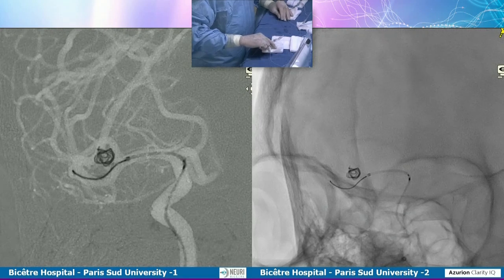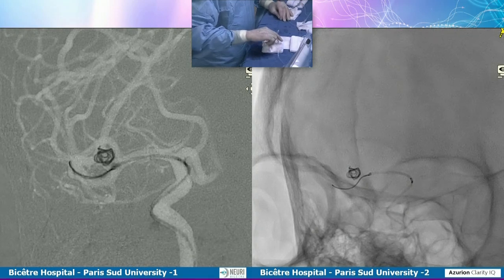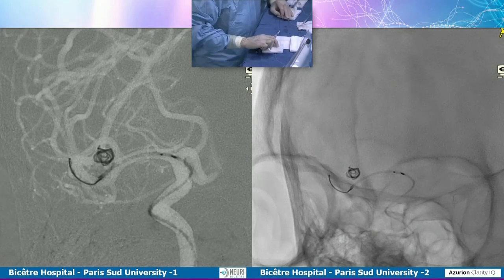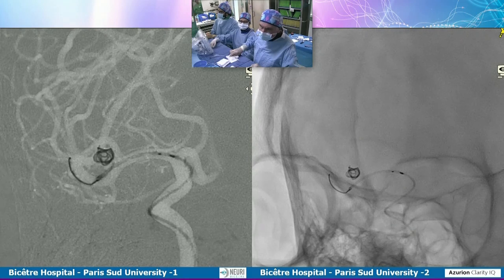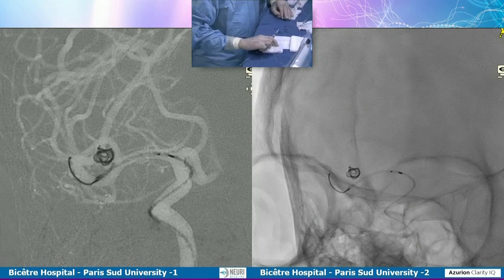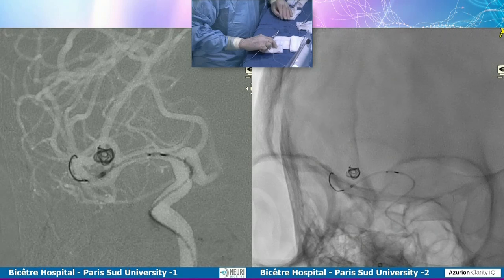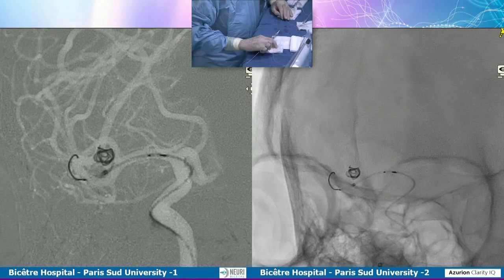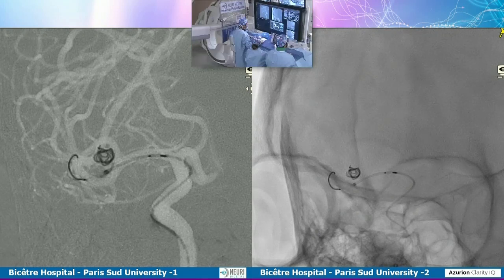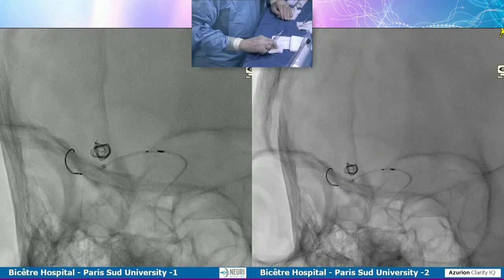Laurent, the simulation that you have would have been a good one to see which of the 2 branches to choose, to see what the flow diverter does. So the simulation provides you 2 pieces of information: the length of the flow diverter, depending on the compression, and also the wall position. It will tell you if you will have a good wall position. Here, in the green color, it's not possible to read, but it means that you have a pretty good wall position.